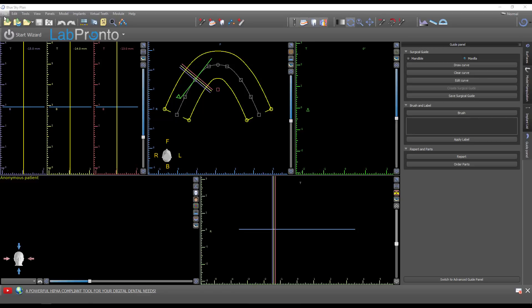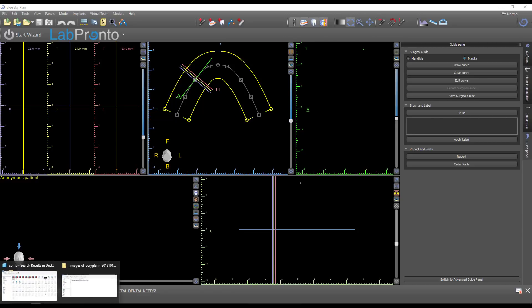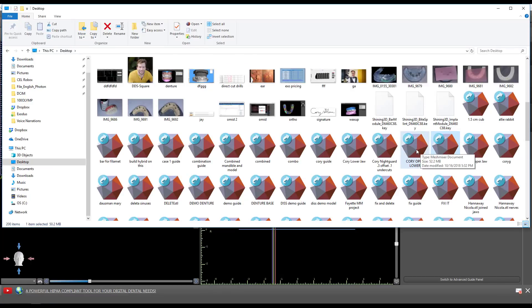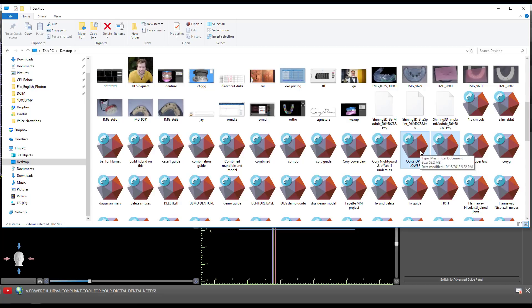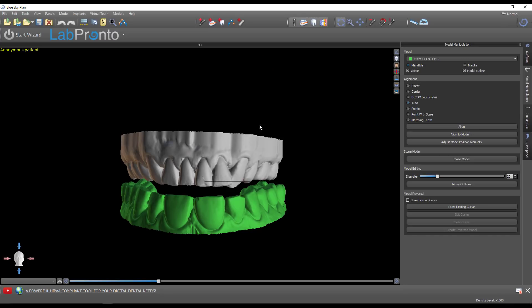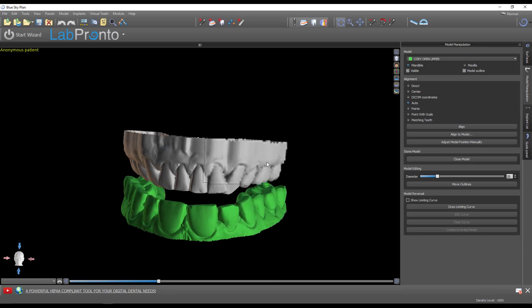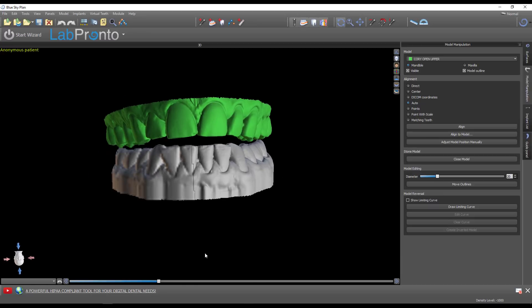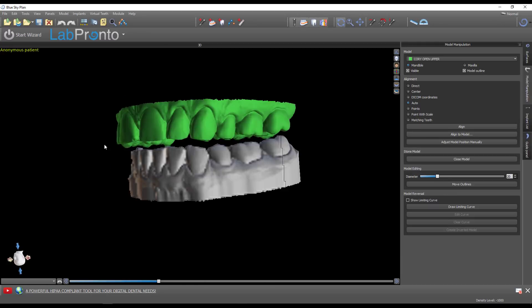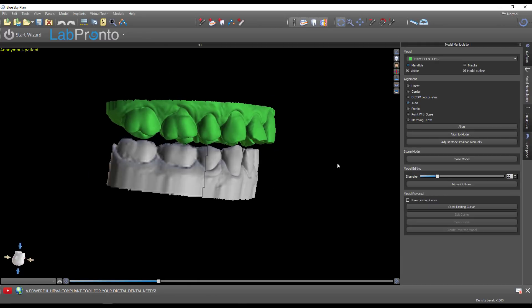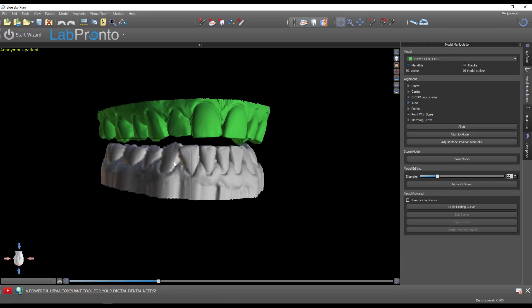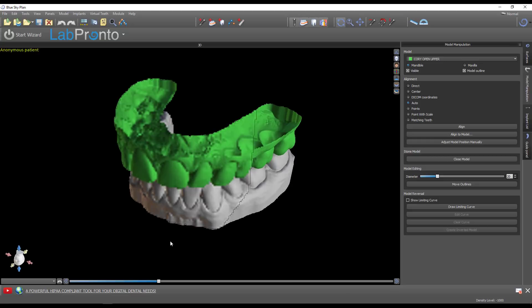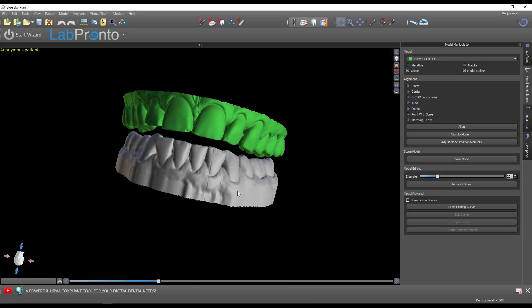We need to start the case by importing the upper and lower models. Find your models, select the upper and lower, control-select both of them, and drag them into the 3D window. You should be in surgical guide mode when you're doing this, not in the denture module. Now we have the models imported - these are scans from a Carestream 3600.